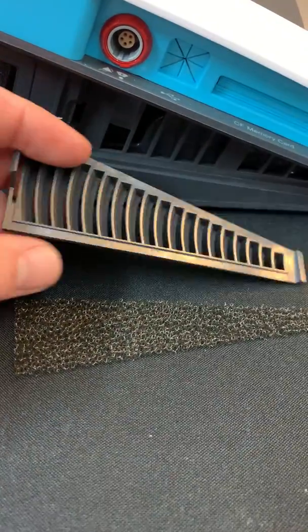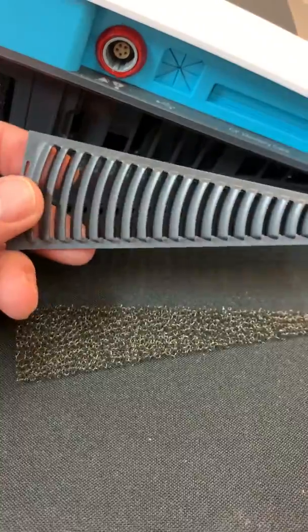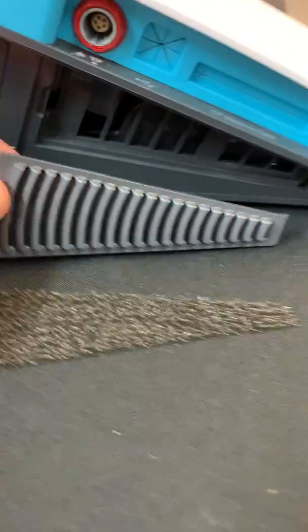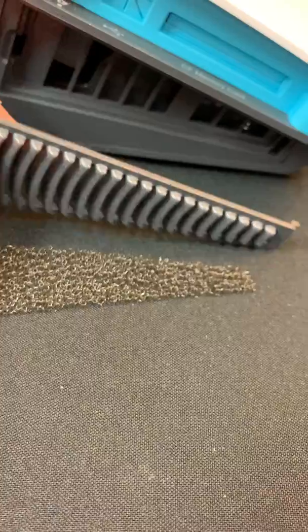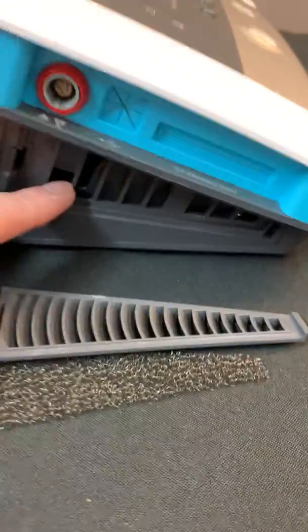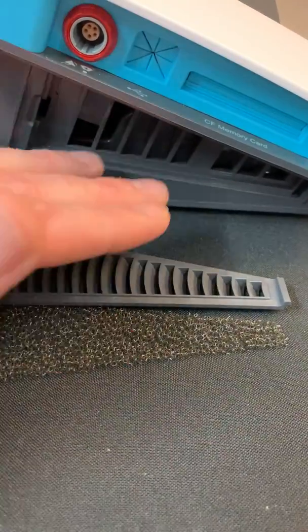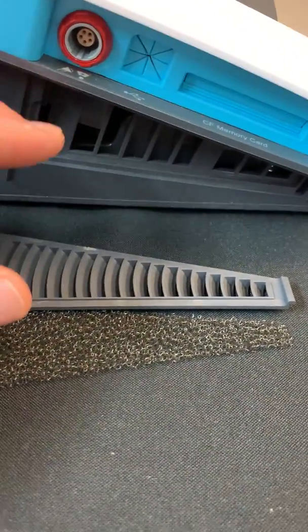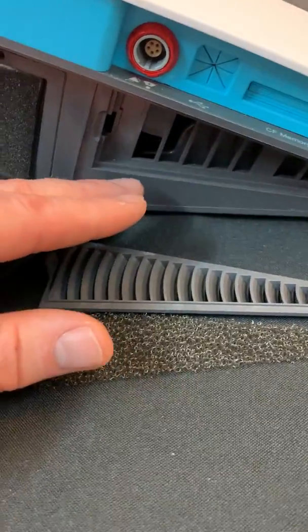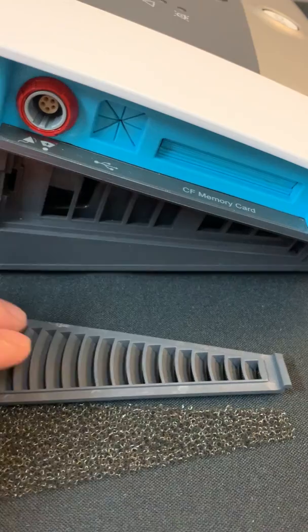You will also find some dust that will collect on the cover as well, so you want to make sure that this cover also remains patent. We're entraining room air to cool the components of the device, so anything that's blocking the room air entrainment is going to potentially have an effect on the ability of the device to cool the inside components.